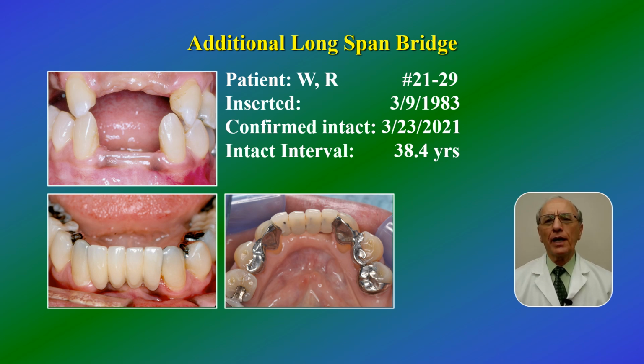This bridge was intact for 38 plus years, but debonded on the lower left canine. For several other reasons, a combination bridge was provided with conventional crowns on the lower left side and etched metal retainers on the lower right side.